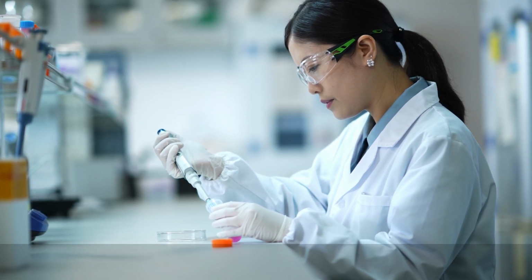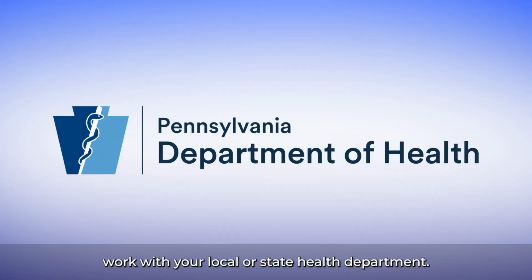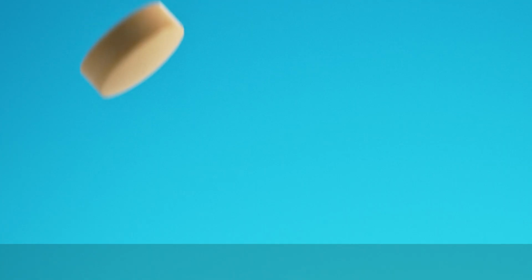Regardless of the method used, you must validate the instrument to confirm that it can identify Candida auris. If your lab does not have the capability to identify Candida auris, work with your local or state health department. You may be able to use a public health laboratory to confirm identification, or a clinical reference laboratory.